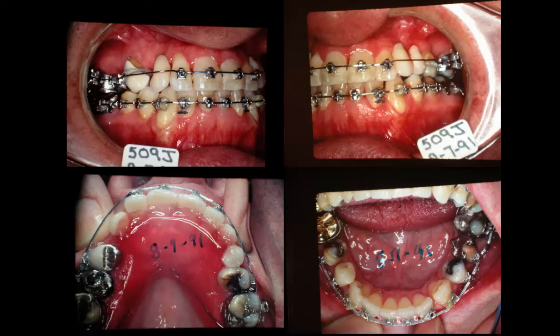We made this retainer and we put teeth on this part and teeth in here, and we've got a bite plate under there so it can't lower anymore. The bite can't go down any further. It's got that built in here, and he bites on that, you see. Got a little bite plate on the retainer.